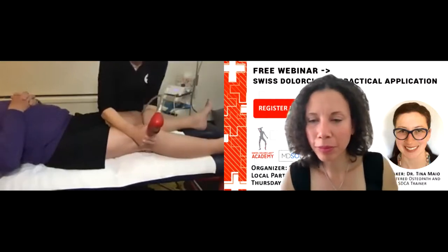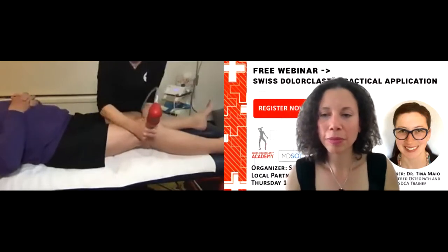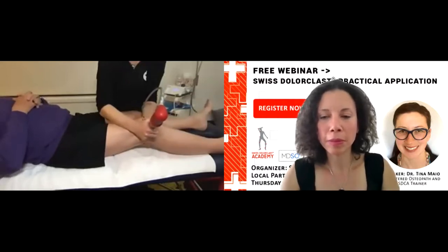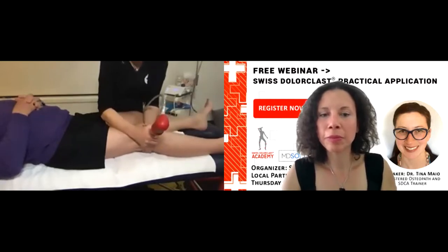And then sometimes I can add a little bit of flexion, because that's what we're trying to do, open the joint a little bit more. So if the patient's okay, I play with the position of the joint. You okay there? And as I'm opening the joint, the shock wave can be deeper. You feel that different? No. Okay. Out of 10, how's that at the moment? Oh, it's a 7. A 7? Yep. Let's drop there. I'm going to drop you down.